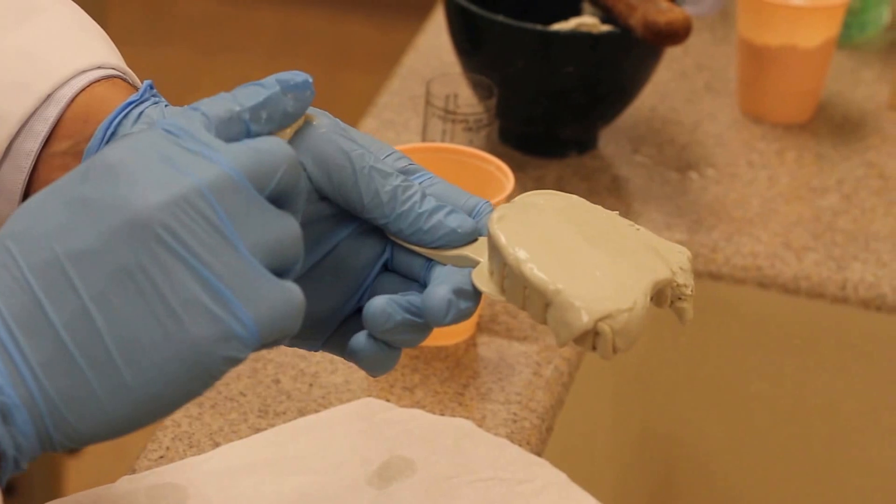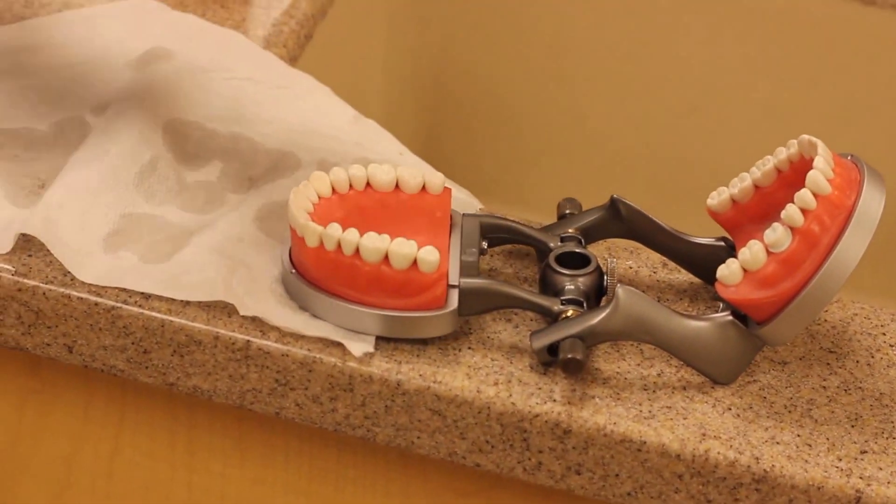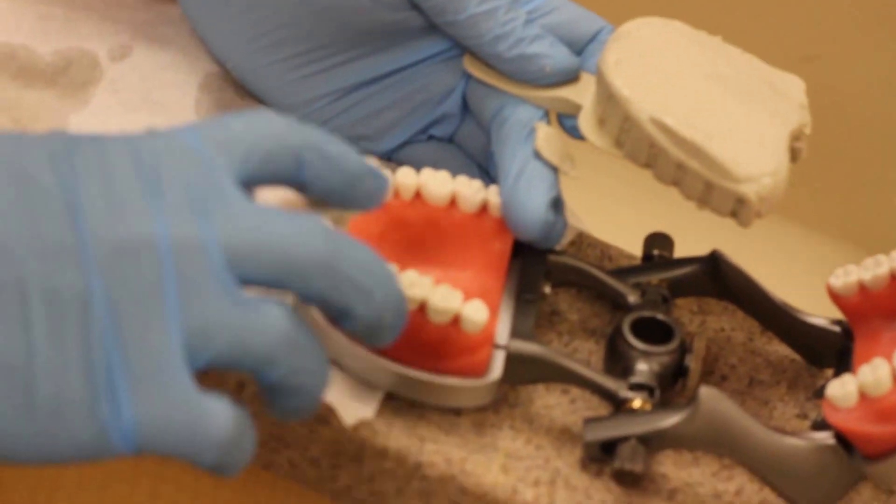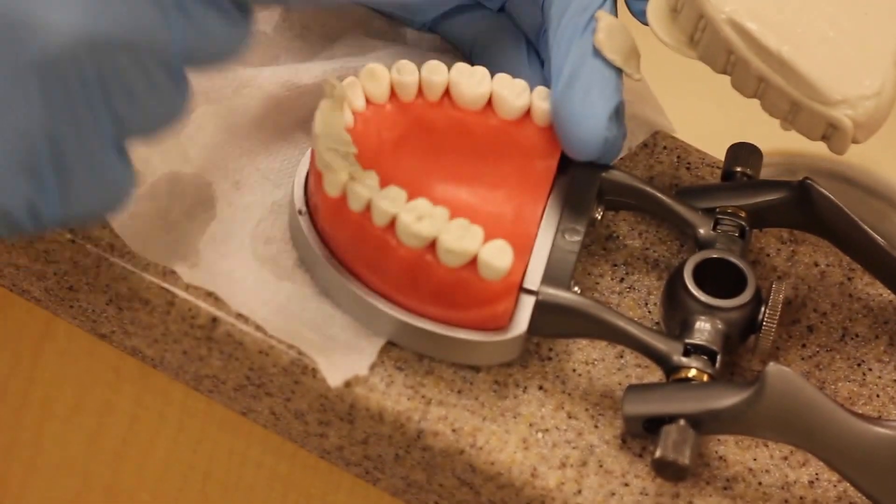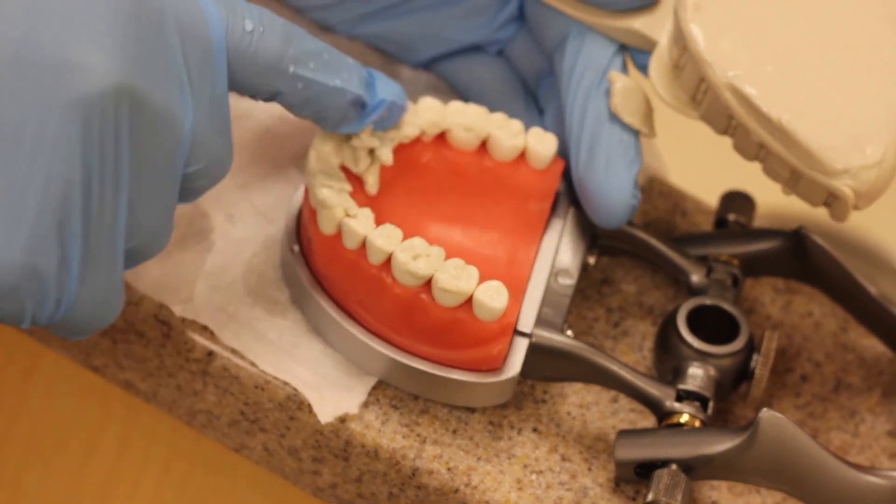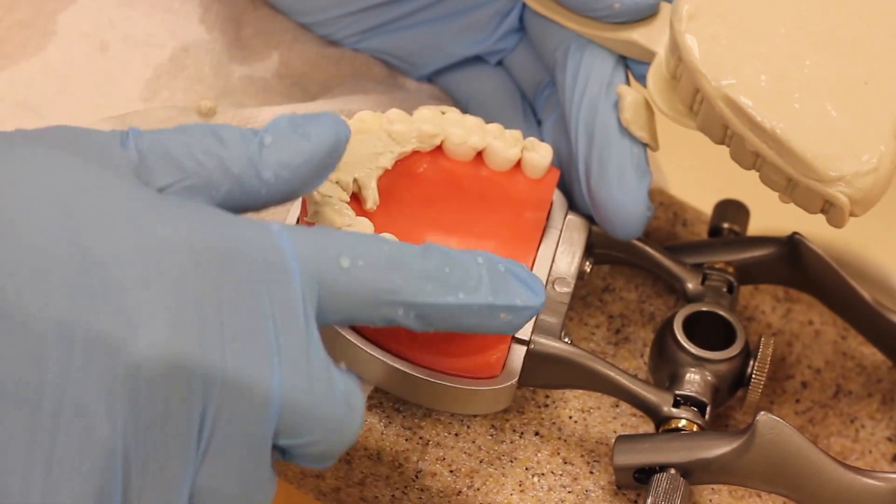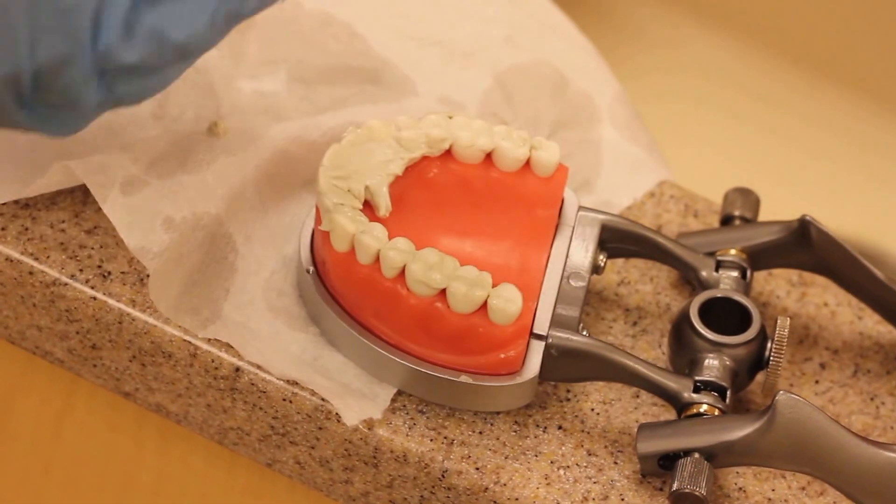And I'll put some on my gloves here. And what's really important is to wipe the occlusal surfaces with alginate because if you want to articulate two casts together you don't want any bubbles and you want all that detail captured.